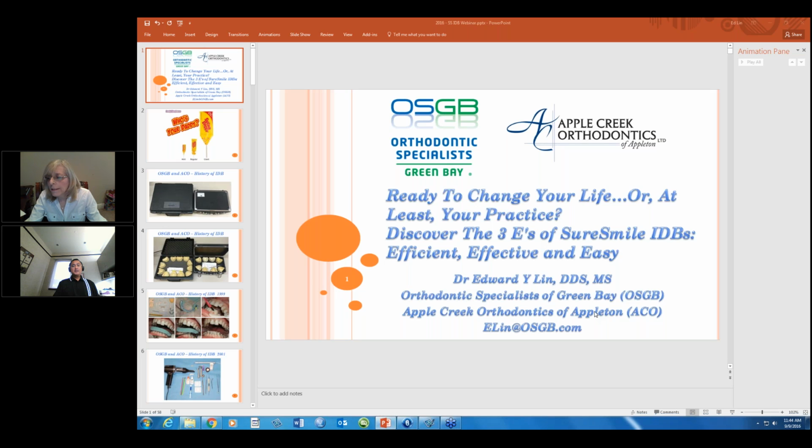Okay. Do you have to click on something to allow you to alter the bracket off the tooth, like those molar rotations? Yeah, you can live in the box, or you can click on the bracket. If you click on the bracket, it'll highlight the bracket, and the bracket turns purple. And you can move it using arrow icons on the actual bracket itself, or you can move to the box and move it mesial-distally, or occlusal-gingivally, or angulate mesial-distal. So I live more in the box. That's just the way I do it. I know that there are some guys who prefer trying to grab onto the bracket and then moving the bracket itself.